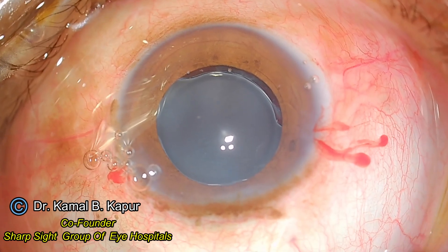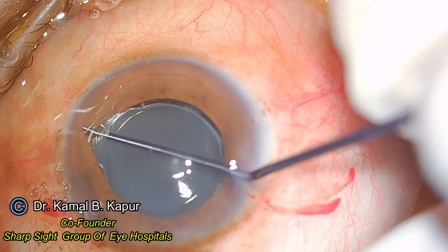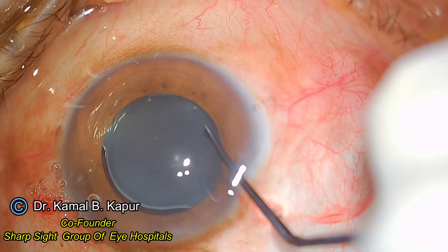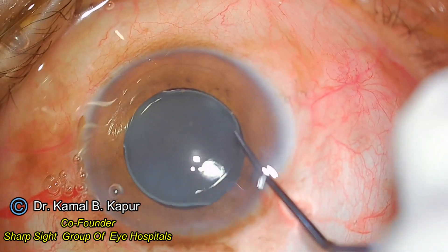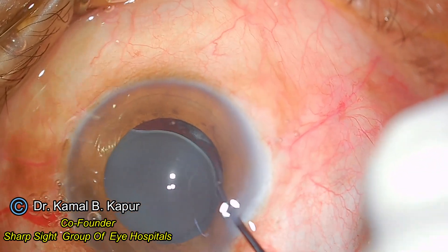Now I will evaluate the position of the haptic. I push back the iris again to evaluate — yes, I find this haptic to be free. This is a big sense of relief for me: the leading haptic of the IOL is free and not caught within the capsule, so there is no fibrosis there.